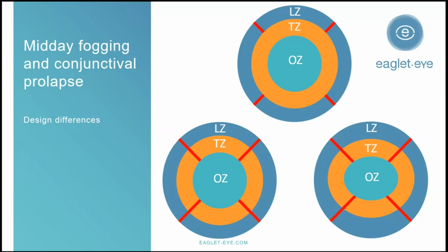Okay, there has to be a differentiation sometimes, and it depends on who's denoted the midday fogging, because it could easily be front surface greasing, and if a patient describes it, they're not able to judge the difference. So I think it has to be clear that the solution Renier is discussing is actually for the actual tear fogging as opposed to front greasing. That's an entirely different issue. Correct, yeah.